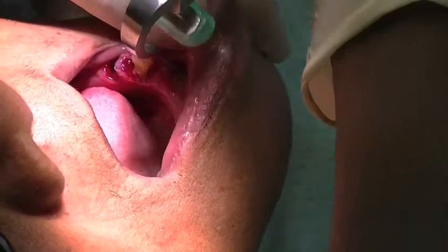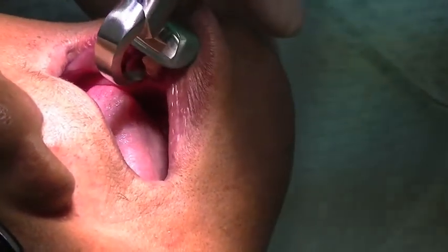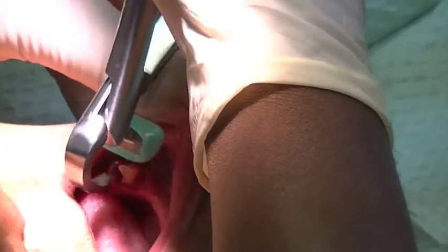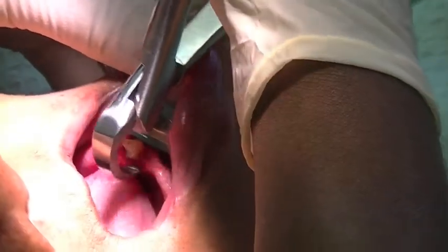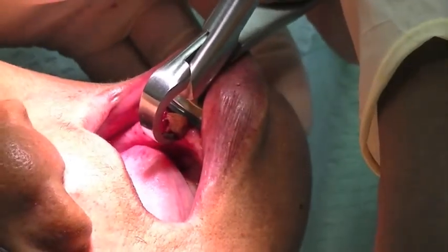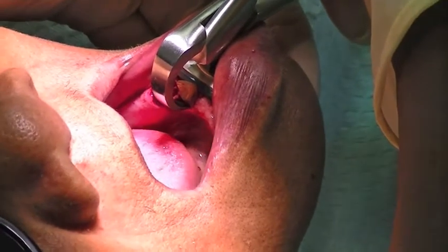One thing I like to do with the forceps is actually have my hand position as low on the handles as possible to maximize the amount of energy that we're delivering to the ligaments.